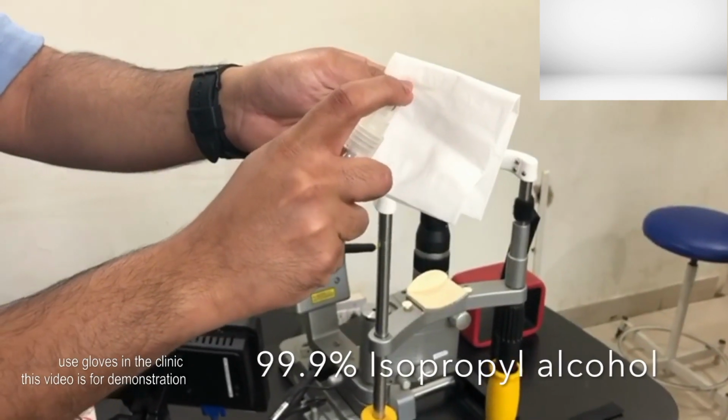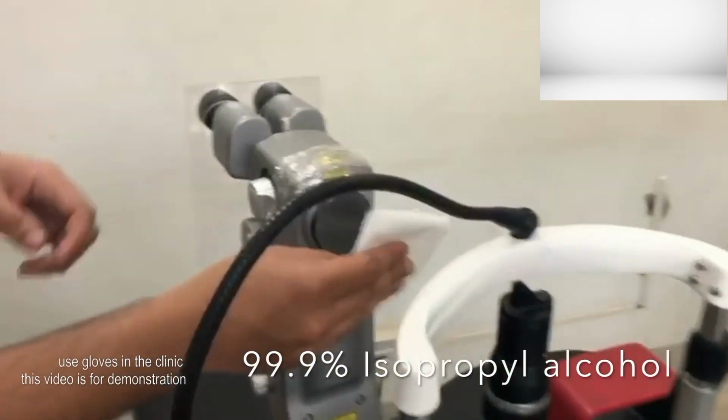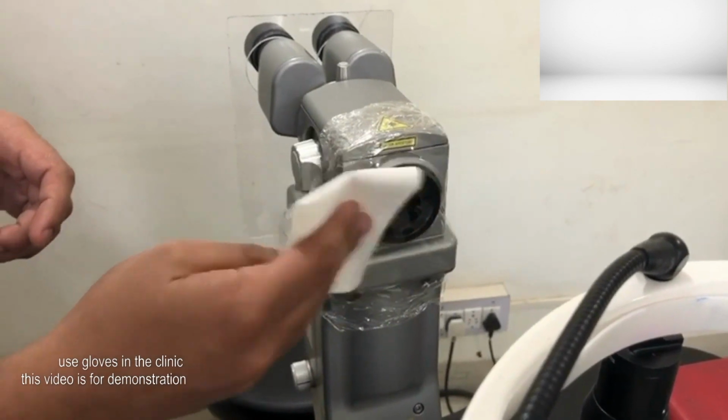For cleaning, isopropyl alcohol can be used. Just spray isopropyl alcohol on a clean tissue paper and clean gently all over. Use gloves while doing so.